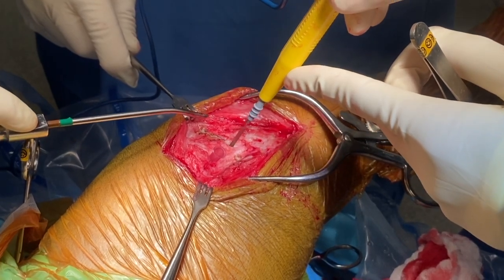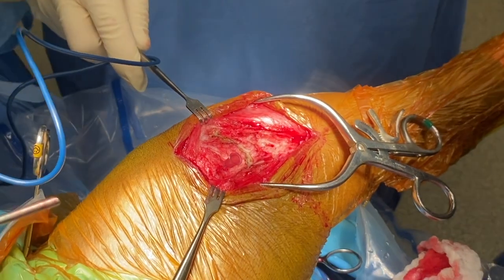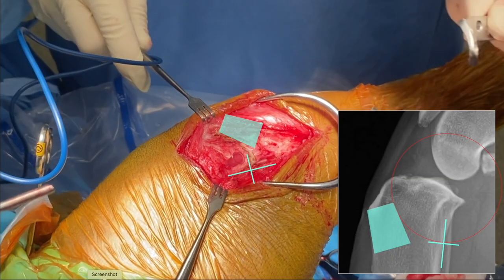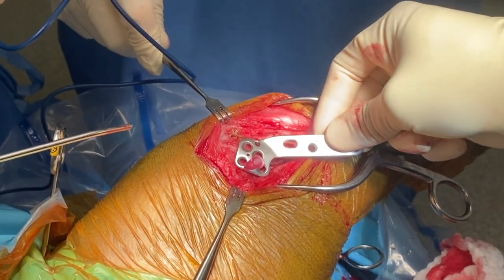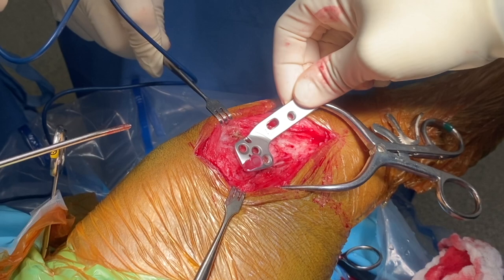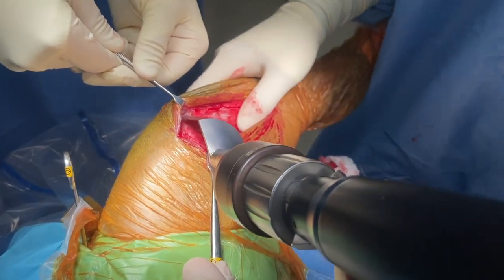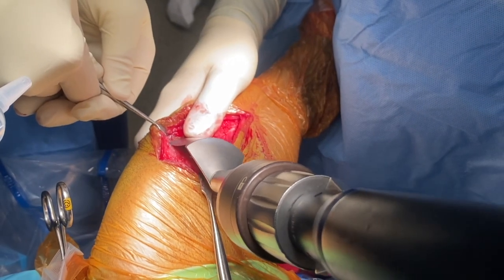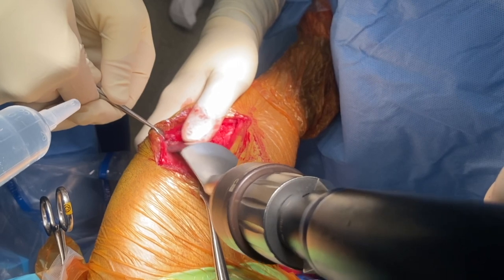Appropriateness of the site is confirmed by ensuring the tuberosity is sufficiently wide and the angle between the blade and the caudal tibia matches the preoperative plan. The proximal aspect of the plate is overlaid over the plateau segment to ensure an adequate fit. The osteotomy is initiated with the radial saw contacting the most cranial and caudal aspects of the osteotomy site with oscillations made in a pulsatile manner.